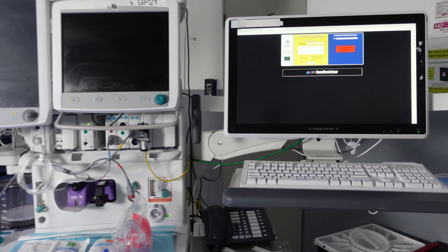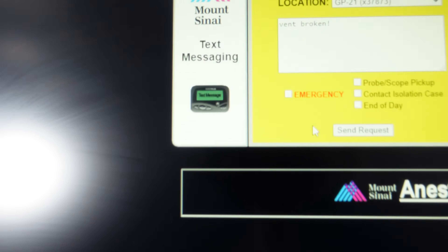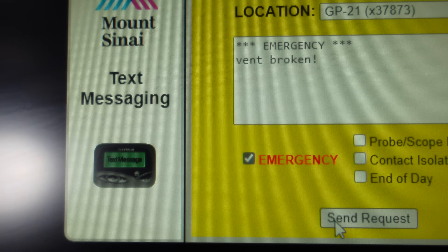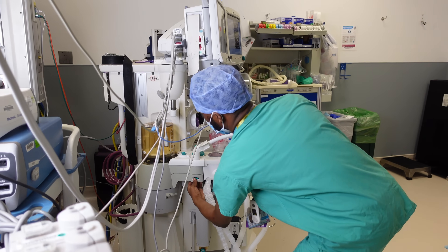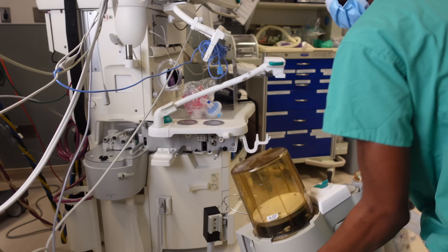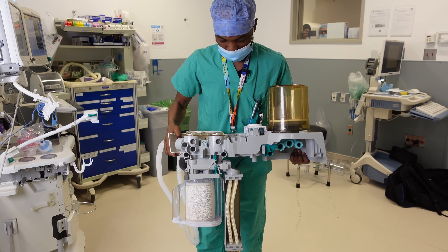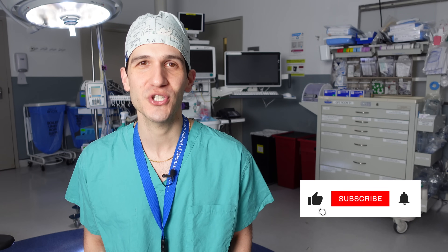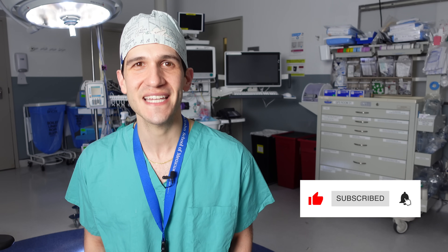My name is Max Feinstein and I'm an anesthesiology resident at the Mount Sinai Hospital in New York City. On very rare occasion, the ventilator right behind me might malfunction in the middle of a surgery. When that happens, I have to send a stat page for help. Who does that page go to and what exactly do they do to help troubleshoot something so critical as the anesthesia ventilator? In this video, I spend a day with Nilsson Flores, the anesthesia tech on the other end of my stat page, to show you what exactly anesthesia techs do and how they play such a critical role in the anesthesia team.